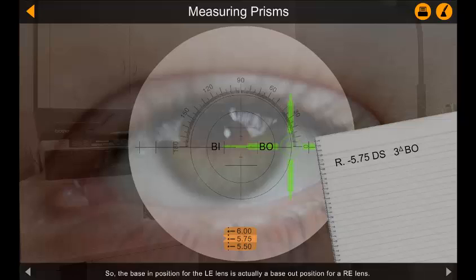So, the base in position for the left eye lens is actually a base out position for a right eye lens. You need to be careful of this type of lens orientation when measuring prisms.